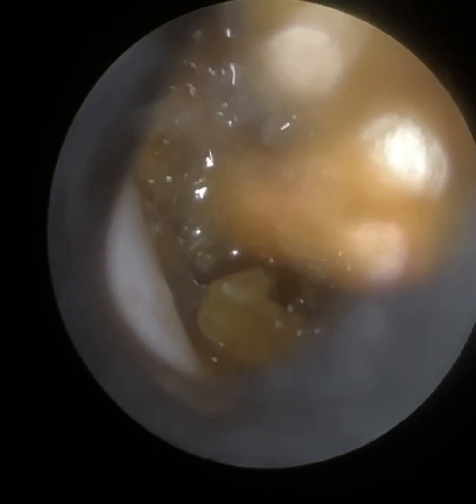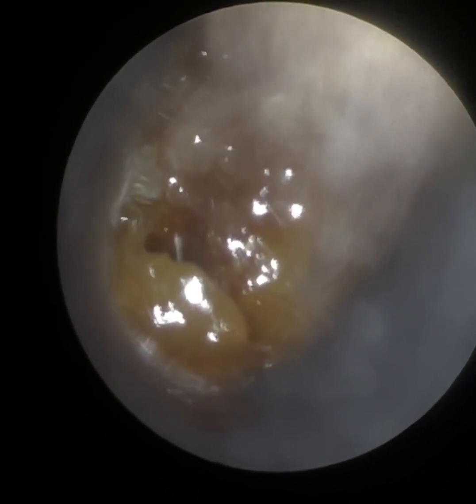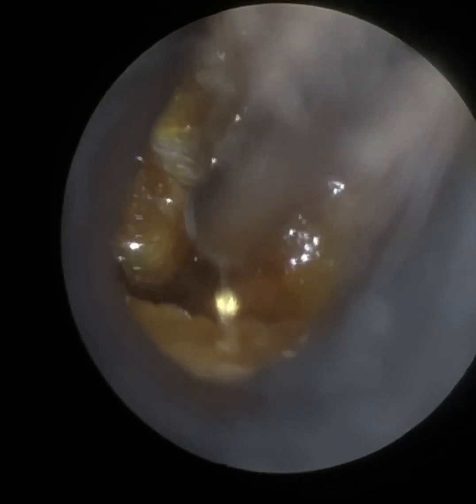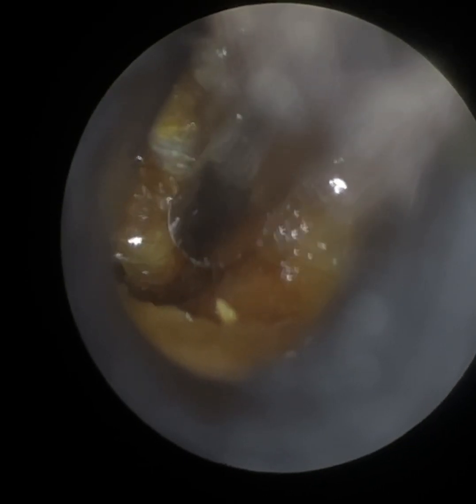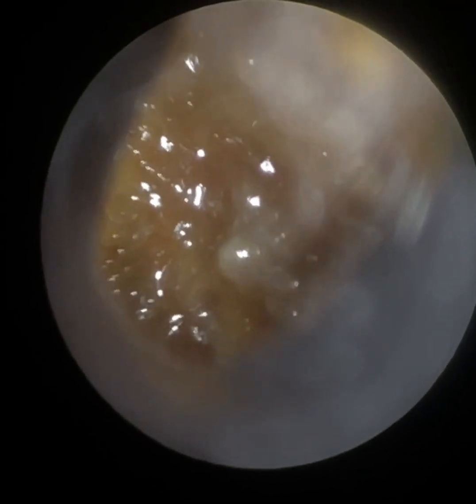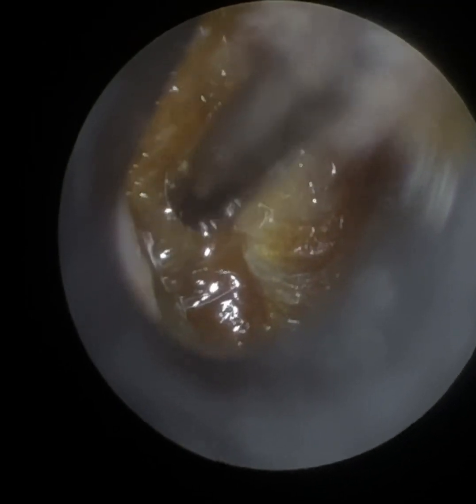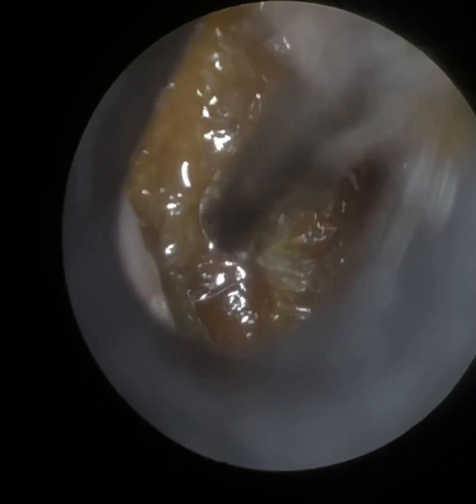Similar to the patient's right ear, I just wanted to get the patient calm, steady, and still. The waxscope did help with that because the speculum is just opening the jar of the ear. Remove the wax posteriorly. Now, this is just some dry keratin wax on the eardrum itself, on the anterior aspect — the front part. So we can see the majority of the eardrum now. This is right on the anterior quadrant. Just going to get the fine end — you can see once it's in view and the focus is there, we're at the right depth. And I managed to just release that off the patient's eardrum.